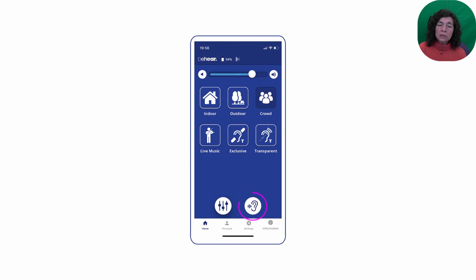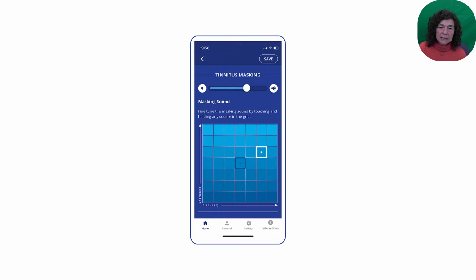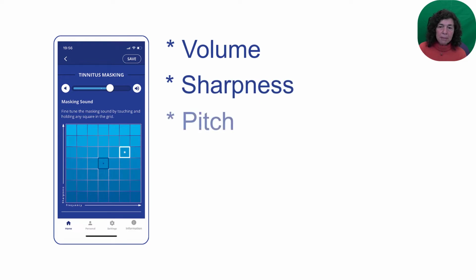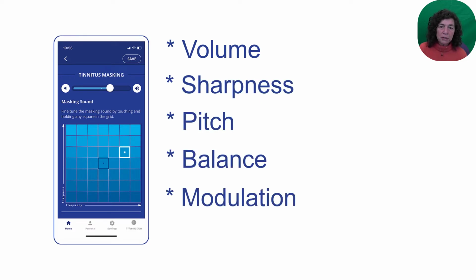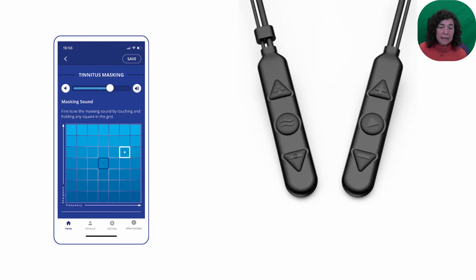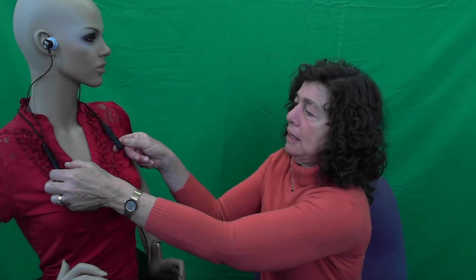In BeHear Access Model 2, we enable the user to determine the masking sound that best counteracts their tinnitus. Using the BeHear app, the user can control the volume, sharpness, pitch, balance, and modulation of the generated noise. The customized sound can then be easily activated and deactivated in personal hearing mode using the headset, by pressing the bottom buttons of both control boxes simultaneously, like this. Did you hear that?